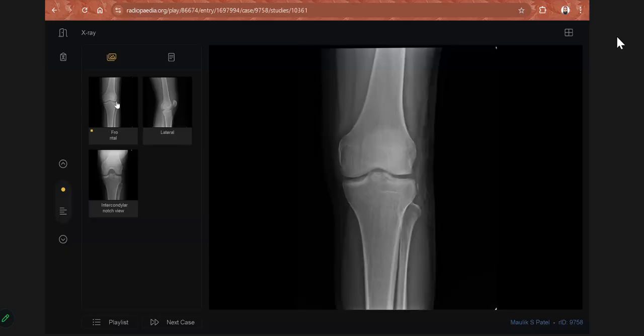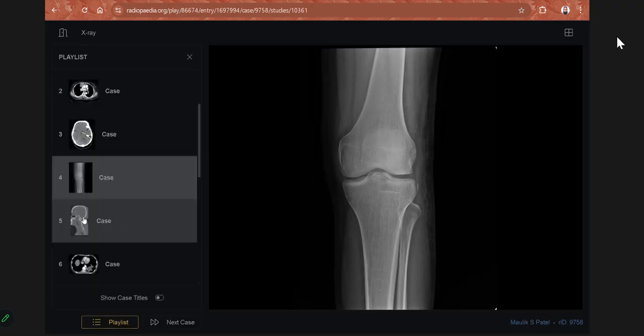But the examiner couldn't give me an MR. So on the plain study, try to complete your case. MSK radiographs are diagnostic. With MSK radiographs, you can give a diagnosis directly, but with abdomen and chest radiographs, you give a differential. For confirmation of diagnosis, always demand a cross-sectional study. Good. So this is your next case, axial.